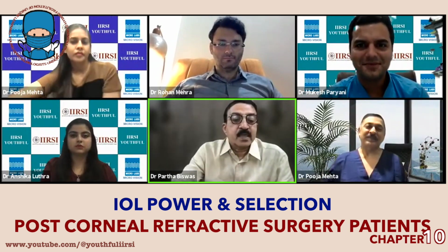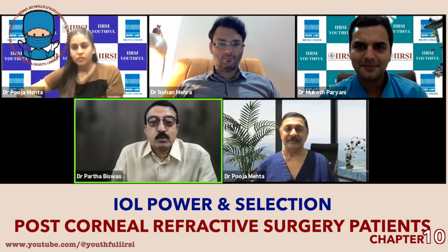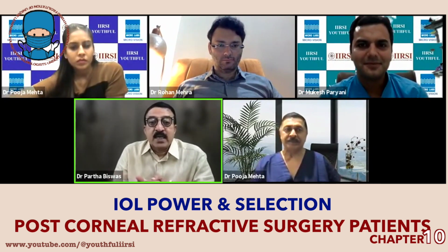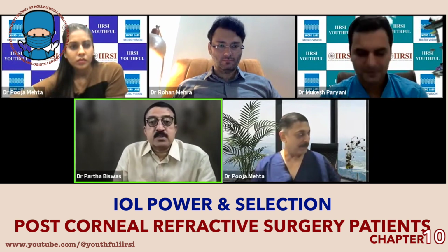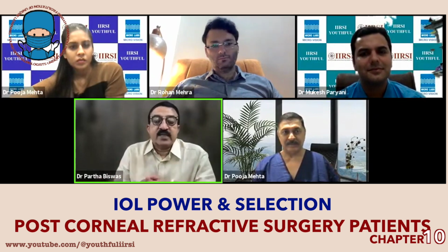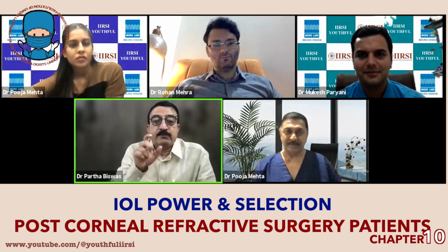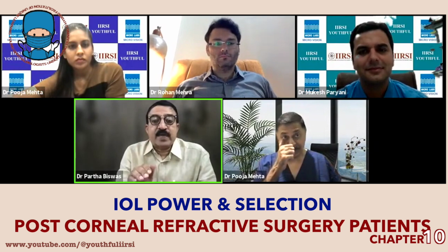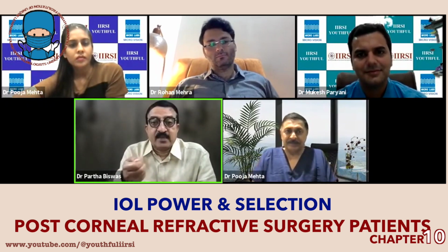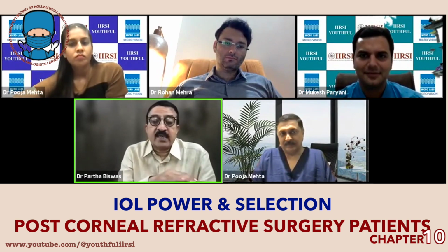Yes, sir. Very nice talk, Mukesh, and it covered everything for our youngsters. Maybe one practical aspect that I would really want to reinstate, and this has been my experience, and I'm sure there are other people with similar experience: before we had all the formulas, we burnt our fingers with the post-refractive, post-cataract surprises for these refractive patients. So quite early, what I started doing is, after extracting the cataractous lens, I got my best optometrist to do an on-table retinoscopy. And that gave a very accurate value. We knew it would not be spot on, and we made it a little on the myopic side. So if he got a retinoscopy reflex of 10, doubling it and making it a little on the myopic side, till date, nearly 10 years now, I've not had a refractive surprise.